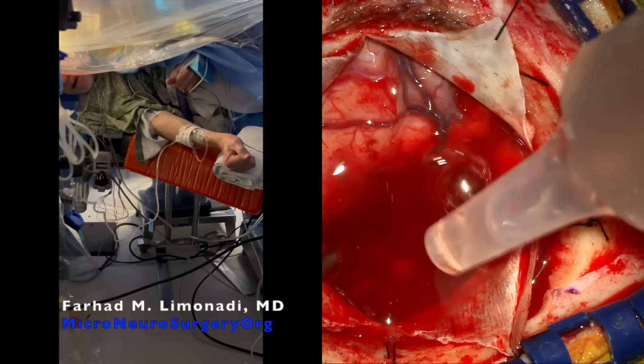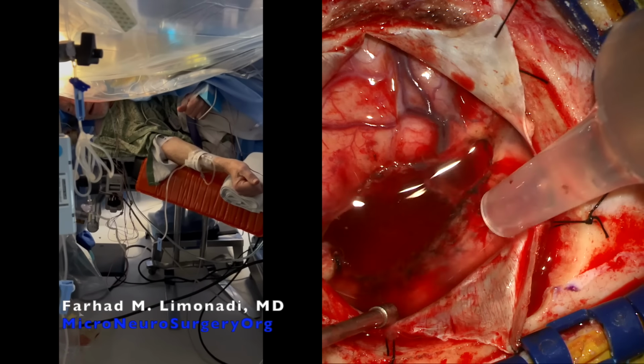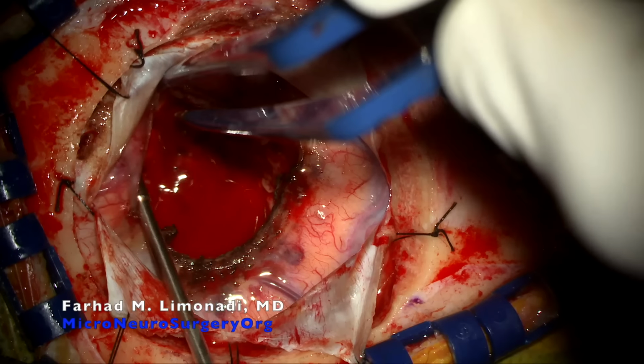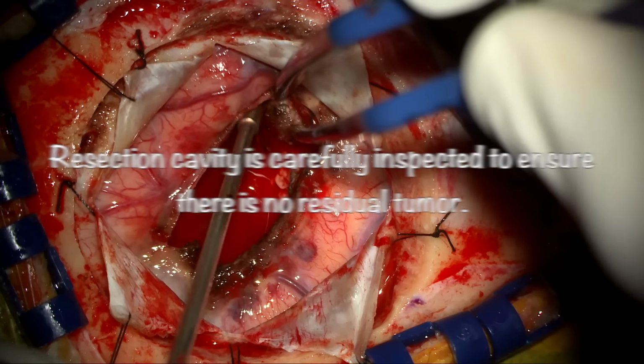All right. Now we are going to need to go around and make sure everything is out. You took the bulk of the tumor. You did awesome. Resection cavity is carefully inspected to ensure there is no residual tumor.